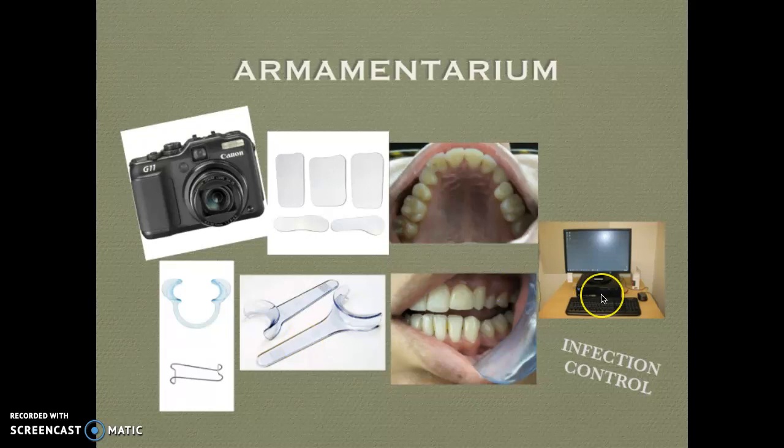And then of course we need a computer to upload these photographs. Usually if you have, of course, dental software, there is an imaging section on your computer where you can upload the photographs.